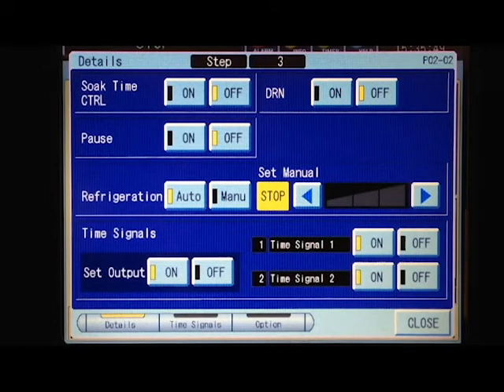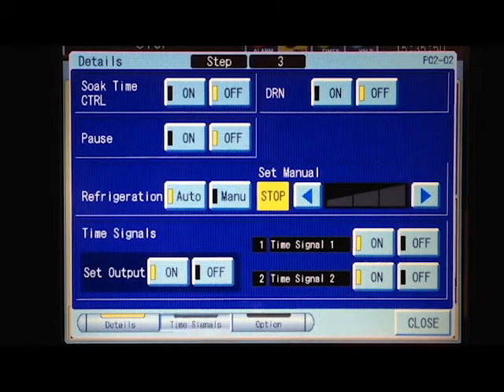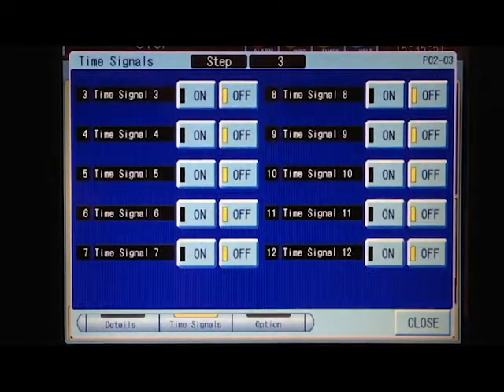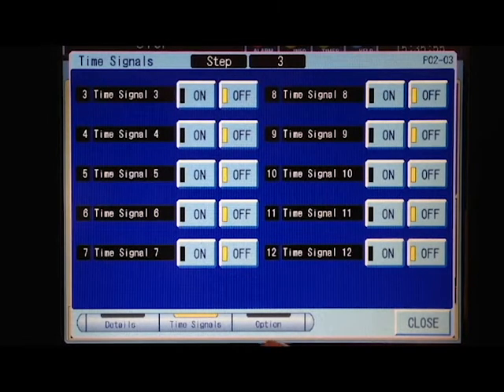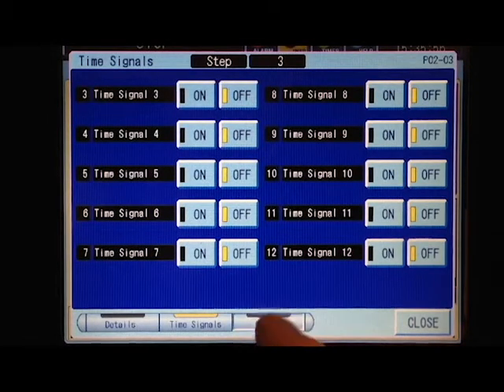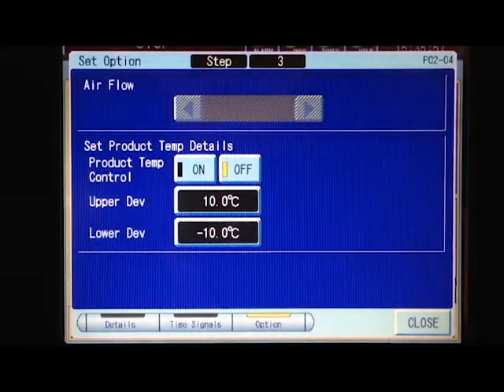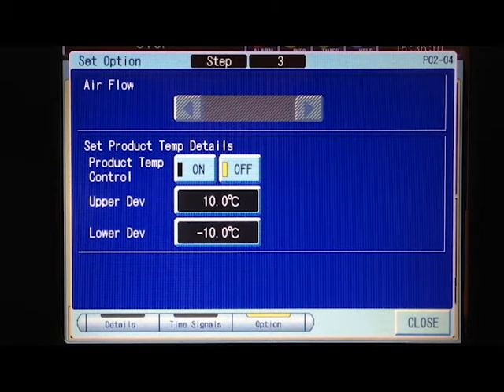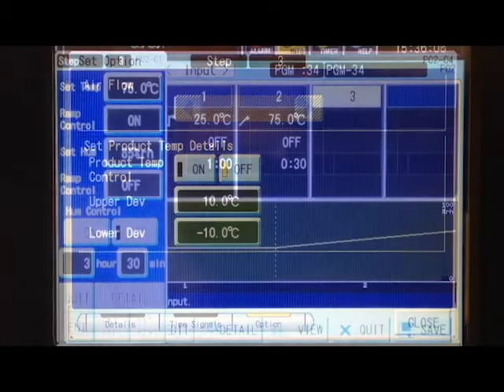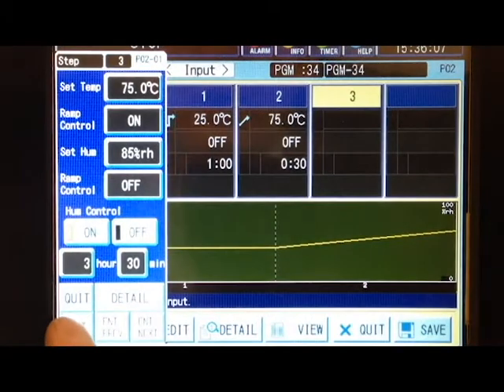You can add additional time signals to turn on and off on this additional screen. These can each be named if needed. Under the option tab, you can manage the product temp control functions for that step by pressing enter.